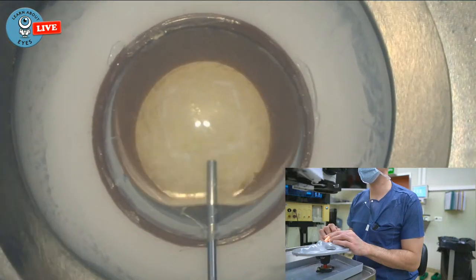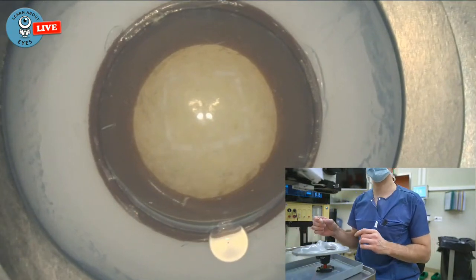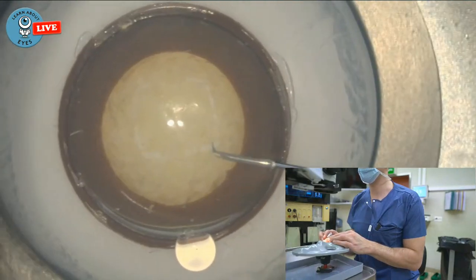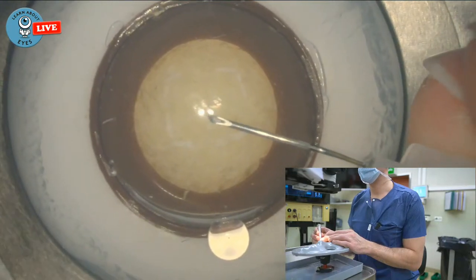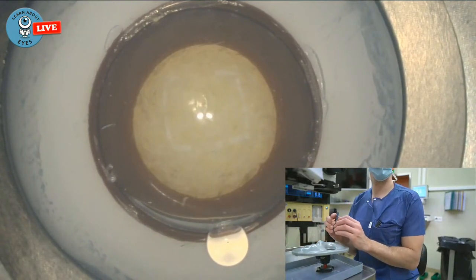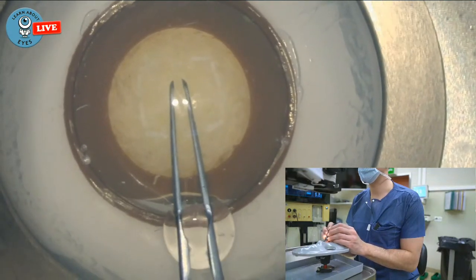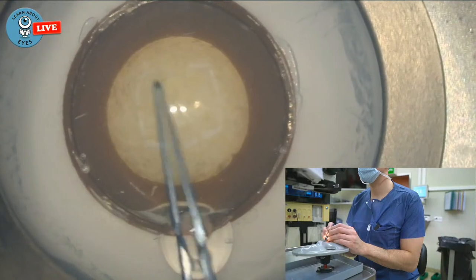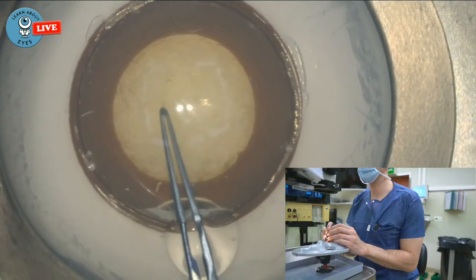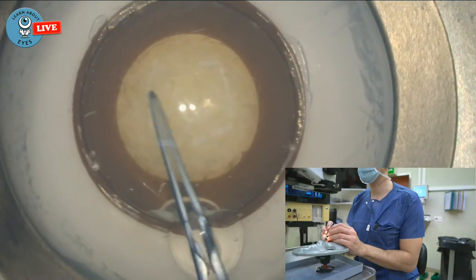So I'm just filling the anterior chamber with viscoelastic. Maybe zoom in a bit, not too much. Then try and find my paracentesis again, which is, as I mentioned, a task. I'm going to use my technique with the incision here. I hope it is in focus enough so you can see something. All right, and then this one is a bit sticky here now, but that doesn't matter too much. I think we can get it to rip.